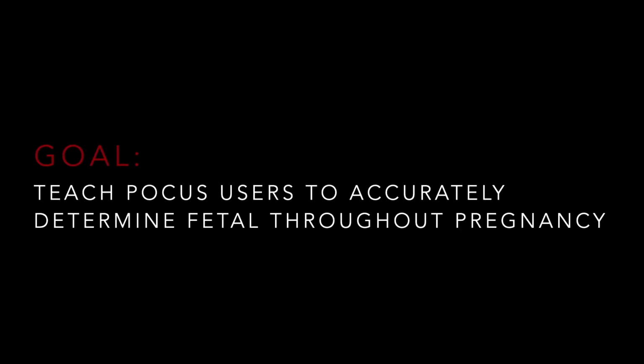We were even talking a little bit beforehand. We have one of our illustrious trauma fellows rotating with us right now. It's been a great time to have him here with us. On first blush, you may say, hey, pregnancy ultrasound may not be the most applicable in the setting of trauma and critical care. But when you think about it, the reality is we see all sorts of patients who injure themselves. And over my career, I've seen a number of pregnant women who've been in car crashes or fallen or been assaulted or various different things.